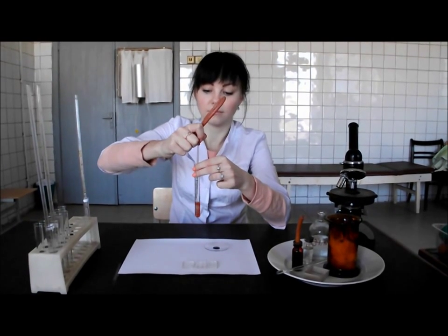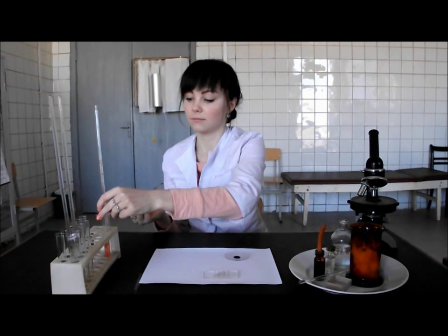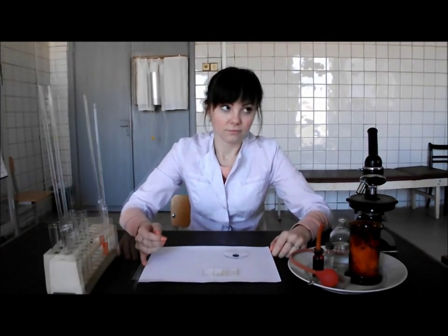Raise the capillary slowly, clean it with the sodium chloride solution, then dry it. Put the capillary on the plate, then slowly mix by slowly swirling the test tube to mix its contents.